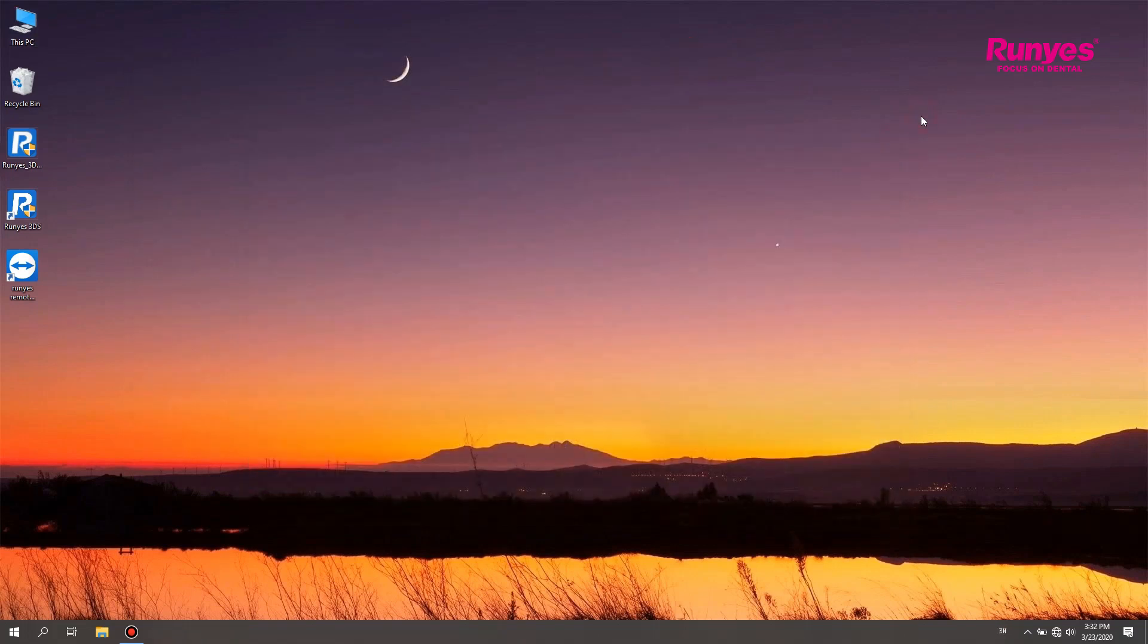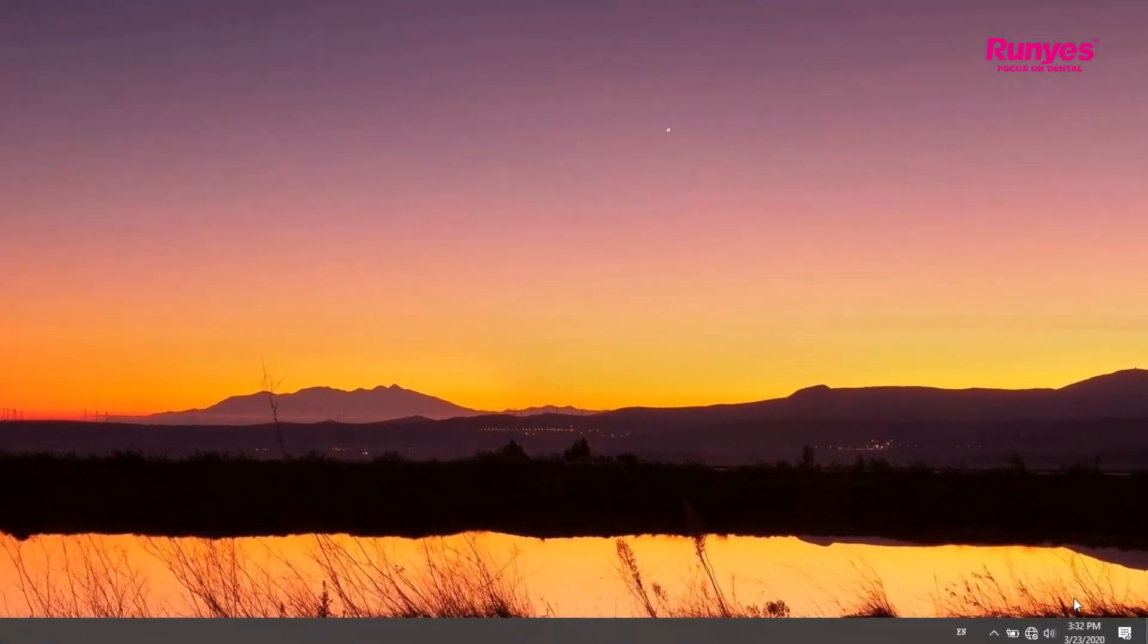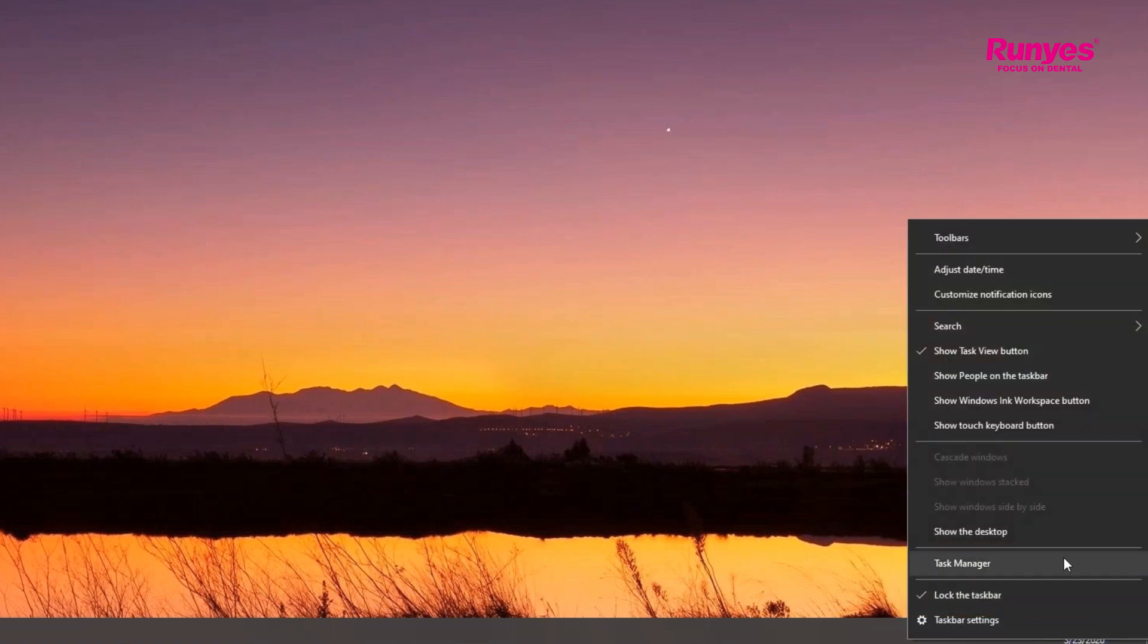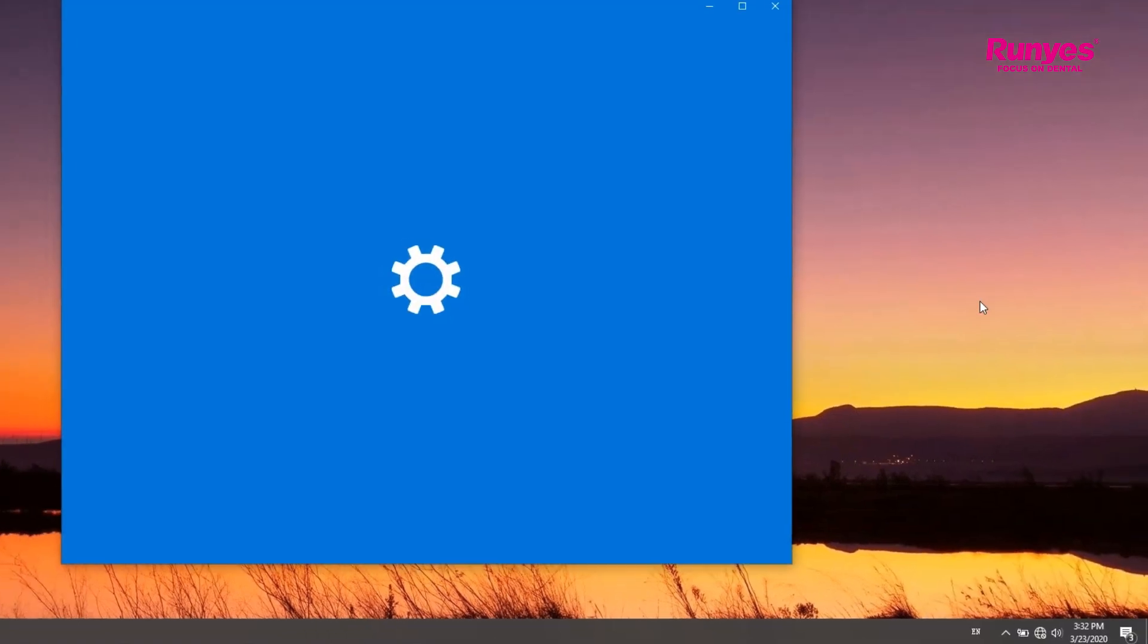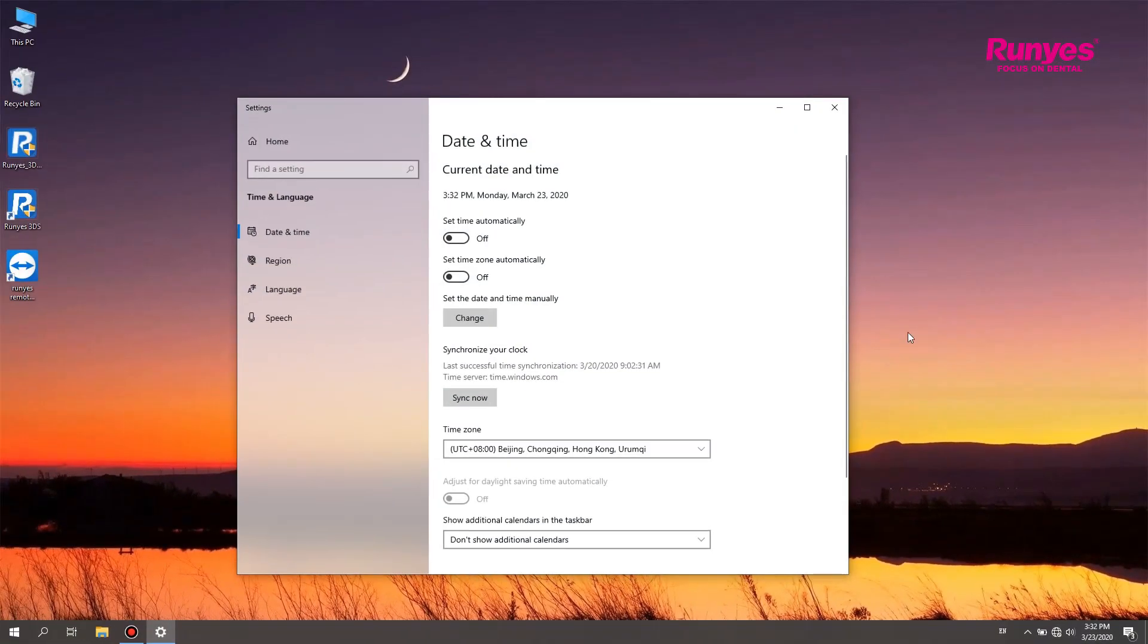Before activating the new software, users need to synchronize the computer time first. Right-click the time bar in the lower right corner to open the menu and select Adjust Date Time to ensure that the Set Time and Set Time Zone automatically function is turned on.